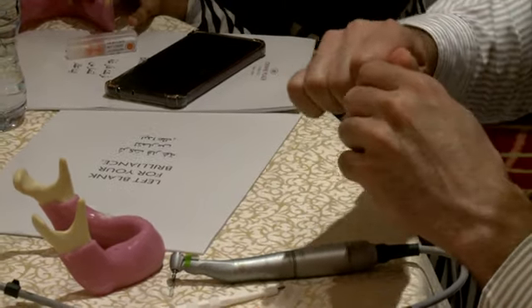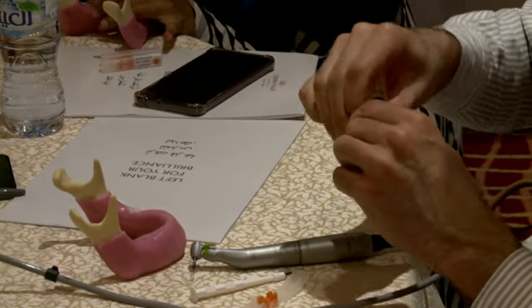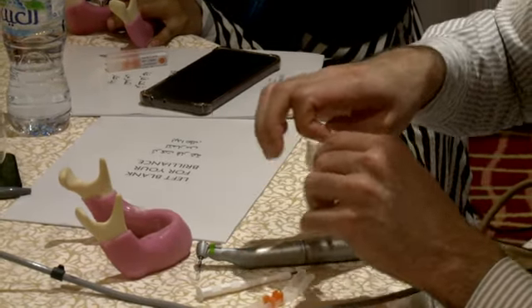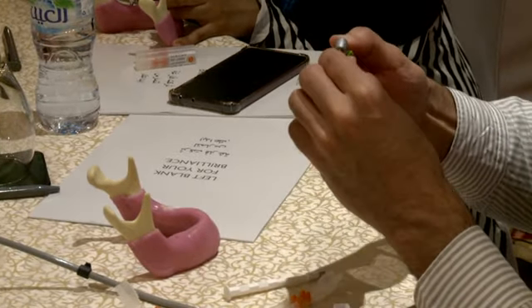We have a limited amount of bone, but enough to place narrow diameter implants in the positions of the lateral incisors in the mandible.